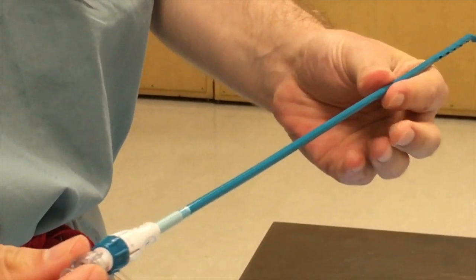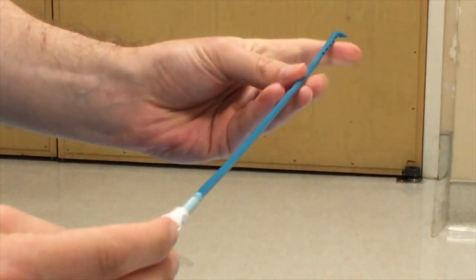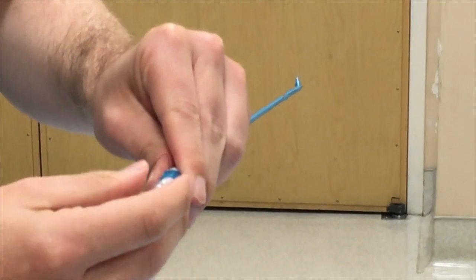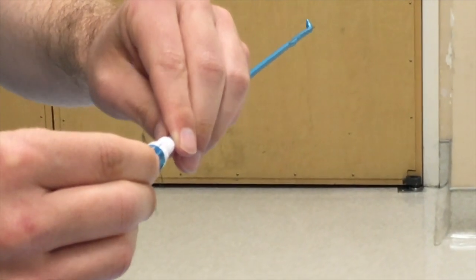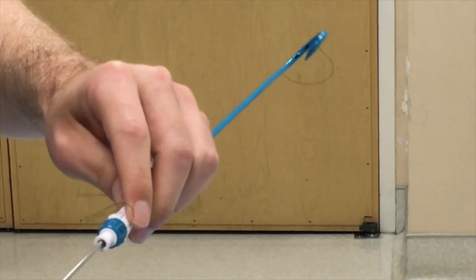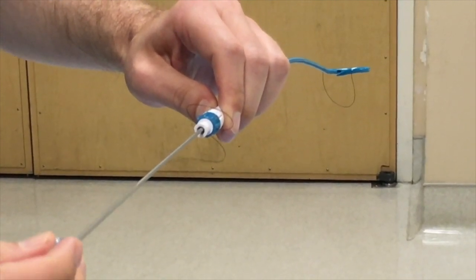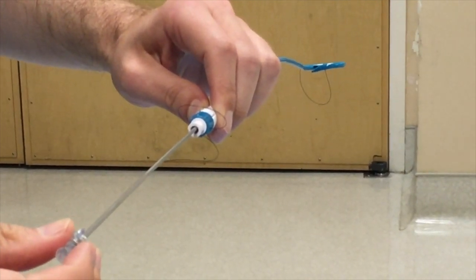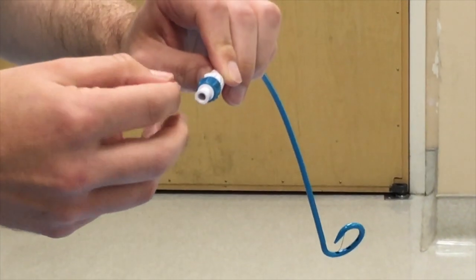Once this is placed inside — again, something to confirm with your attending or fellow — once you get the tip in a good location, you're going to go ahead and release this. The stiffener will help the initial part of the procedure to get the catheter to the right area. Then you'll release it, hold the stiffener with one hand, and continue to thread the rest of the catheter further into the collection. As it comes off, it'll start to form the curve. Keep advancing while maintaining the stiffener in the same position so you're not forwarding it, because you can cause trauma to adjacent organs. Eventually you'll have the stiffener out, the catheter will be in the collection, and then you'll pigtail it.